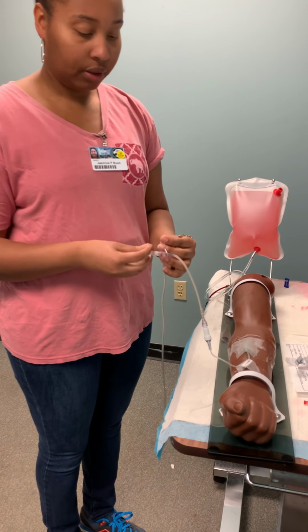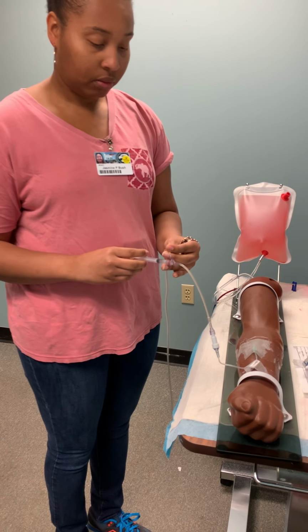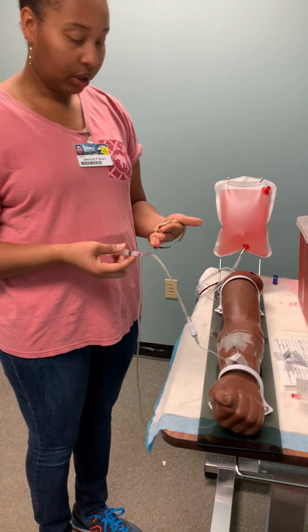All right, I'll clamp it. Let it run for another minute.